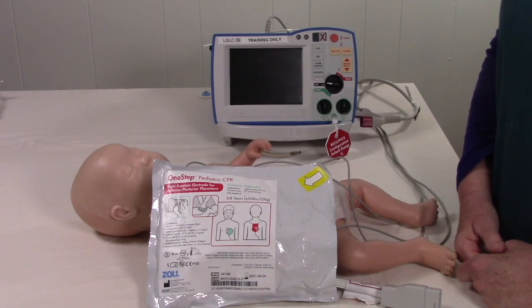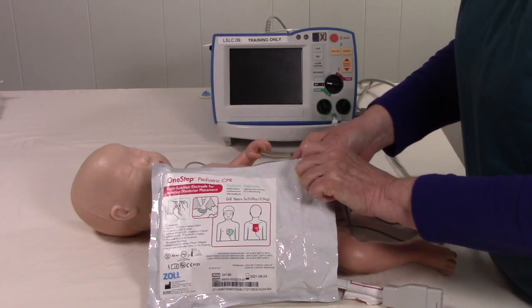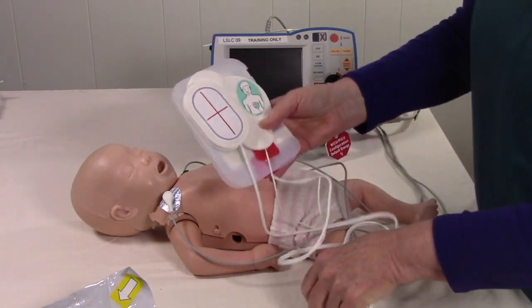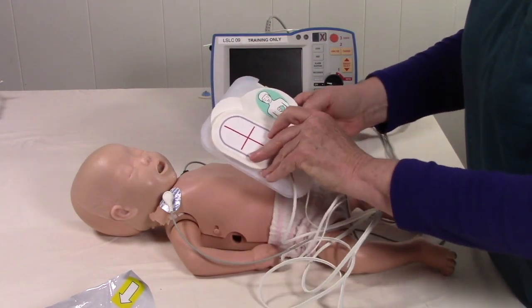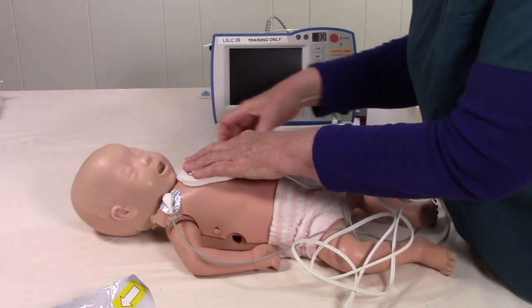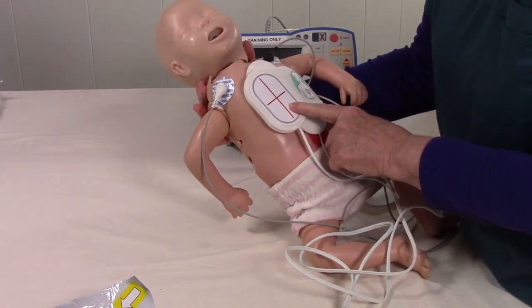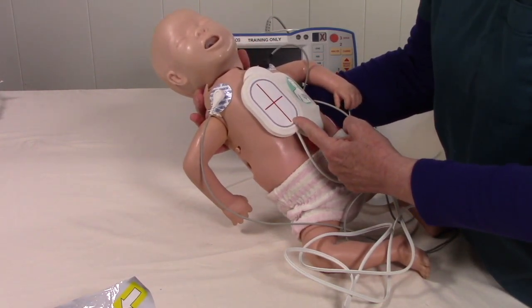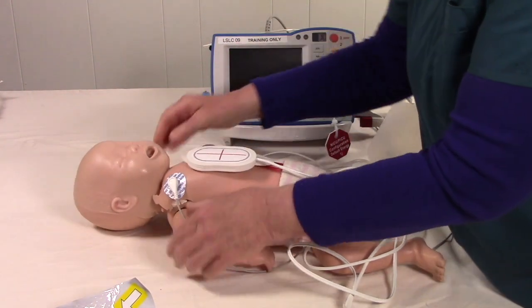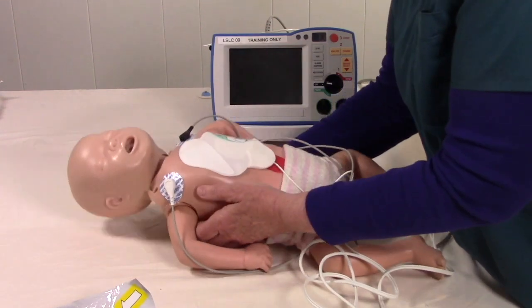Now let's go over the use of the One Step Pediatric CPR pads in the neonatal ICU. Get your package and open it as indicated by the arrow. The picture will show you exactly where the pad goes on the patient. Take them off one at a time. First, we're going to place the anterior pad. Notice the CPR disk shows you exactly where you're going to be doing CPR. If this is too large for your infant, you can remove it.